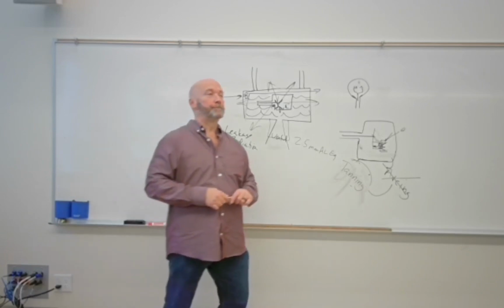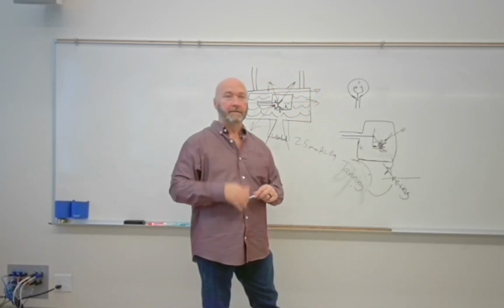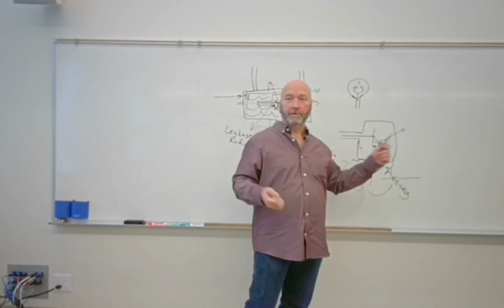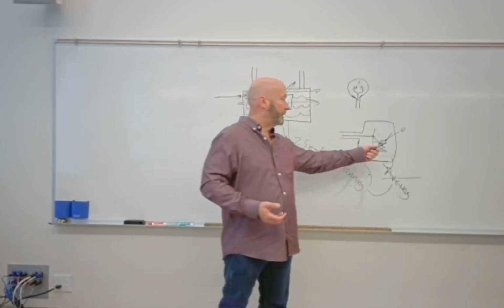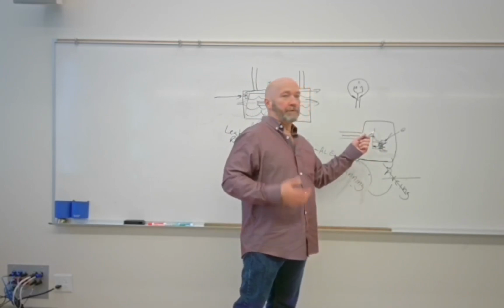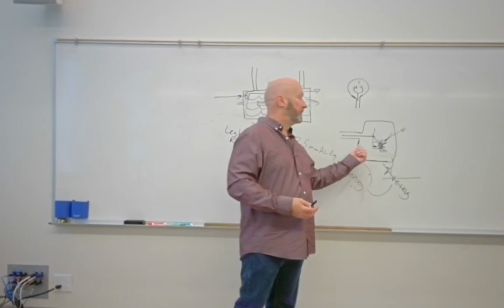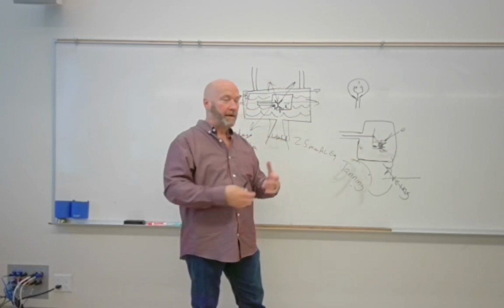So we don't use pure tungsten in either one of those, for those reasons. We want the good thermionic emission. We want it to not distort, but it's so fragile that if you bang around your X-ray tube, you very well could break it. So we put a little bit of thorium in the filament. We use tungsten in the target for the same reasons, sort of. We don't want thermionic emission, but we do want conductivity and a high melting point. So we put a little bit of rhenium in the target to help it not shatter from rough handling.